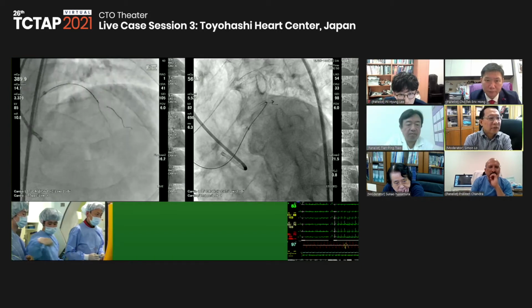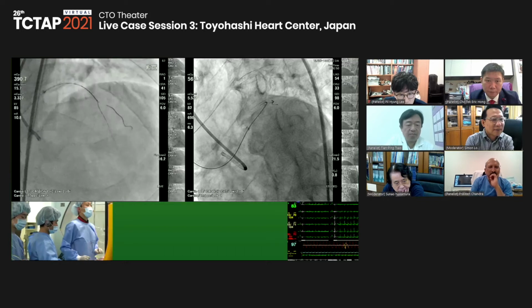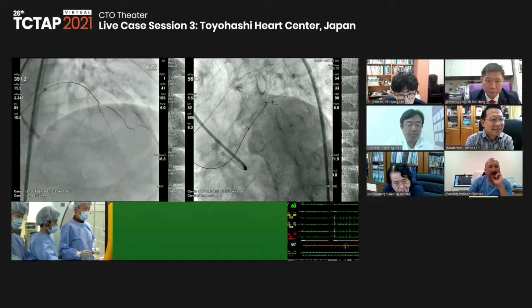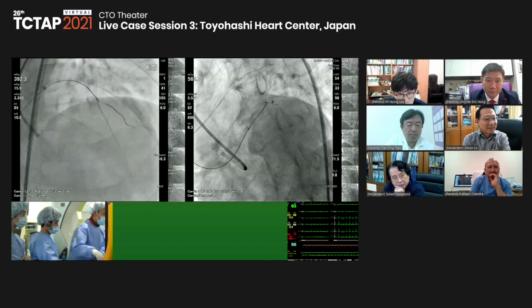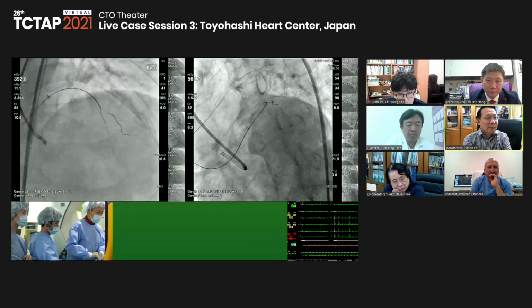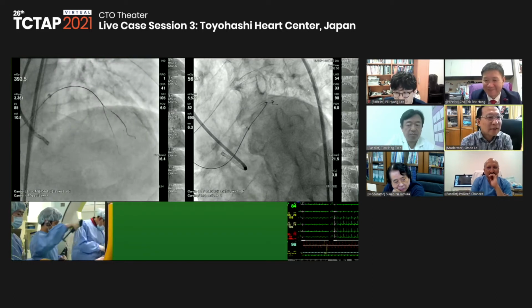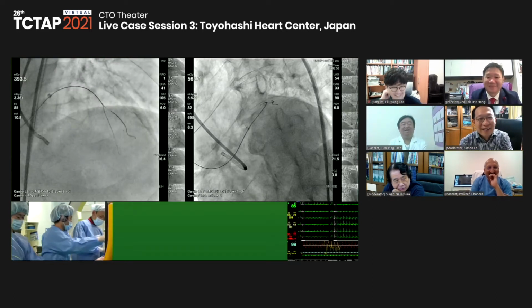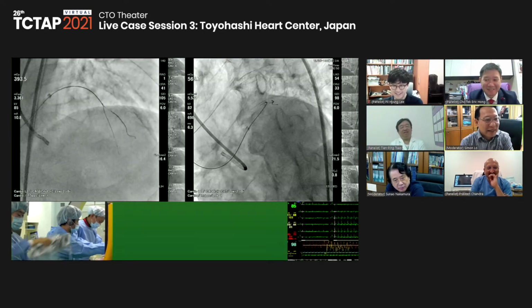Would you do a retrograde injection now and see where we are? Yes, maybe we don't need to do retrograde injection. Antegrade injection is better. So after removing the DLC, I will check the angio. You're making it look too easy, we have 1 hour. One hour is too short for the CTO intervention, right? Do we have another case? Stand by.